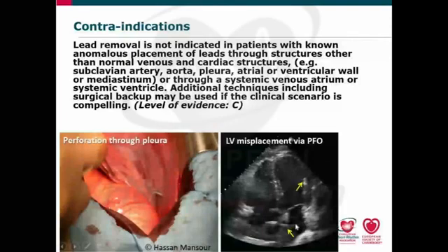And also, if the leads are in the systemic circulation, then there's a big risk of emboli of fragments from the lead, unless, of course, the lead was just implanted there very recently. In all the other situations, it's better to have them taken out surgically.